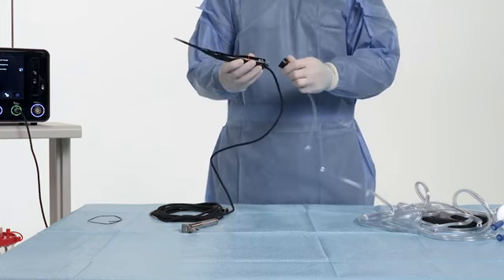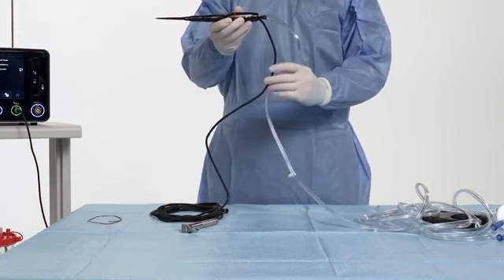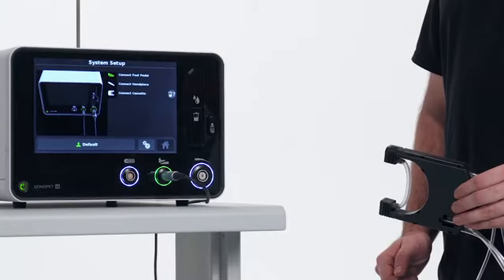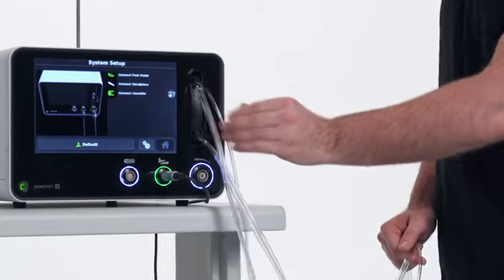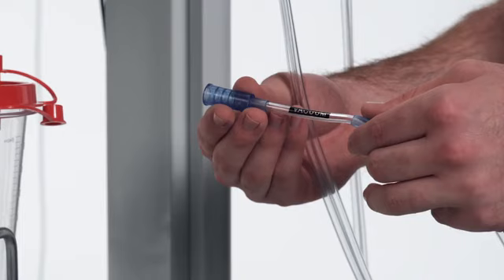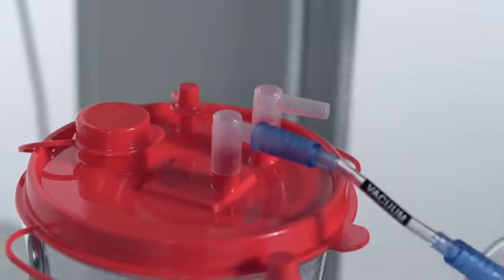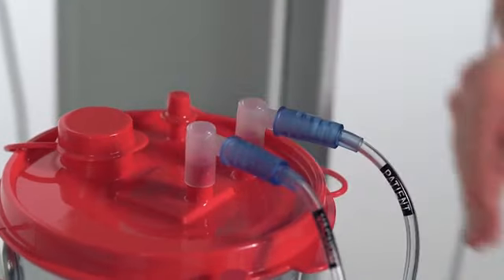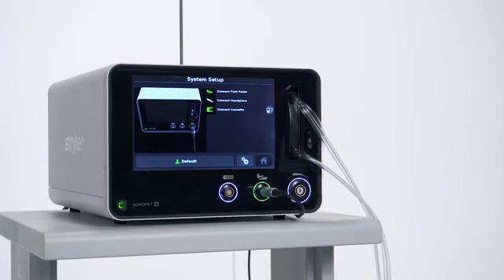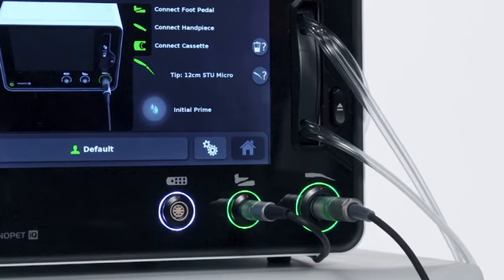Attach the cassette tubing connector to the base of the handpiece. Attach the clips on the irrigation and suction tubing to the handpiece cord. Insert the cassette into the console until an audible click is heard. The cassette icon will turn green. Attach the suction tube connector marked vacuum to the suction canister port marked vacuum. Attach the suction tube connector marked patient to the suction canister port marked patient. Plug the handpiece plug into the handpiece port on the console. The ring surrounding the handpiece port on the console will be solid green and tip name will appear, signaling correct handpiece setup.